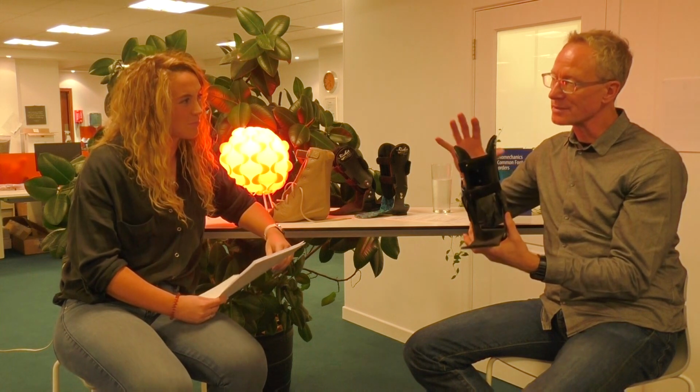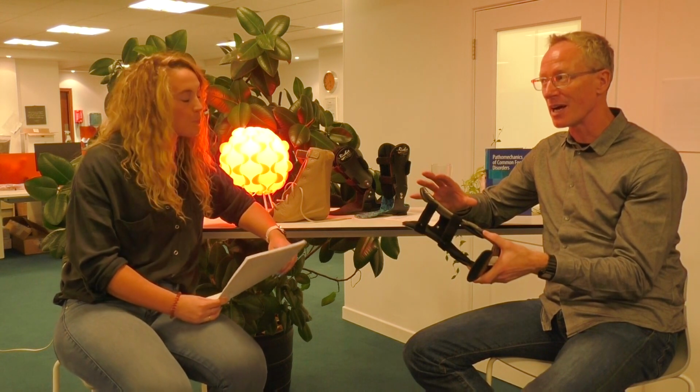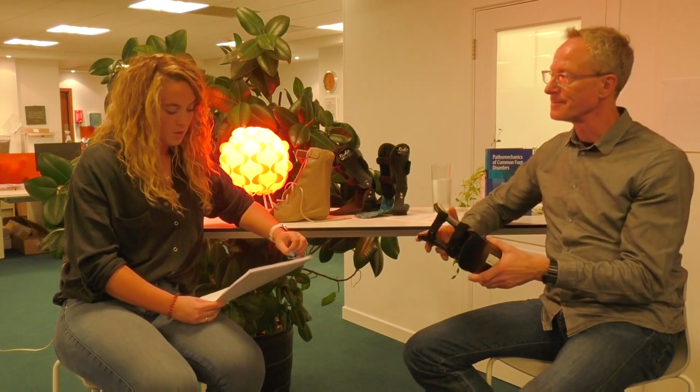Yeah, and interestingly, for the benefit of the audience, you may use the Richie brace for a period of time, so it's a rehabilitative tool. Yeah. And you may be saying to someone, you're going to use this for the next 8 weeks, 12 weeks, 6 months, or even 12 months. And then you're going to progress out of the Richie brace and into custom-made foot orthoses.